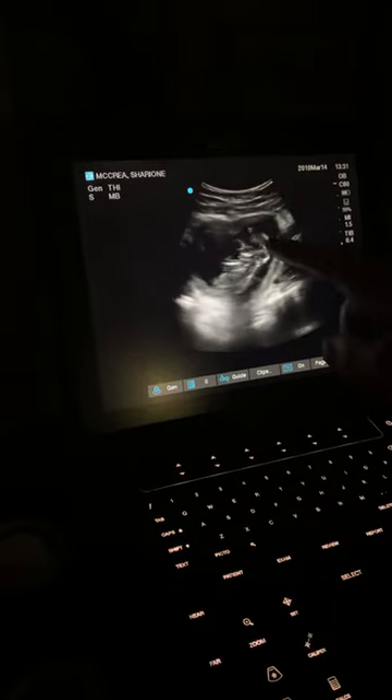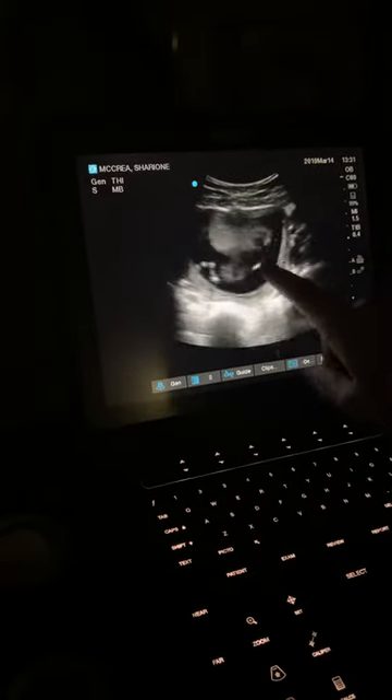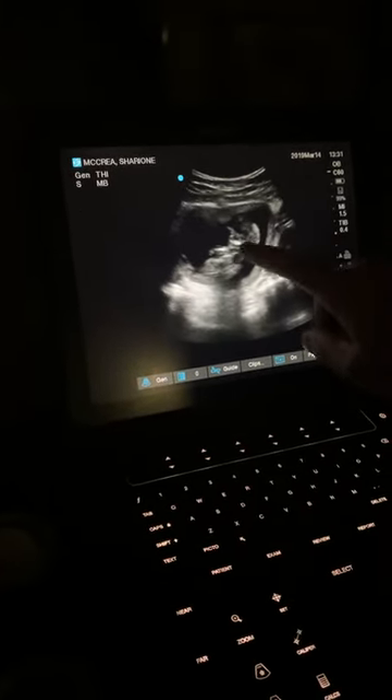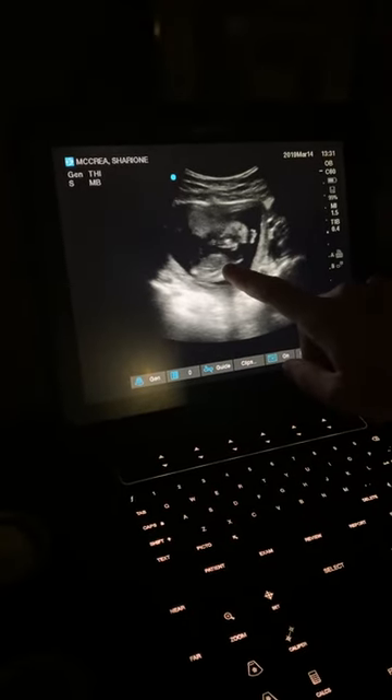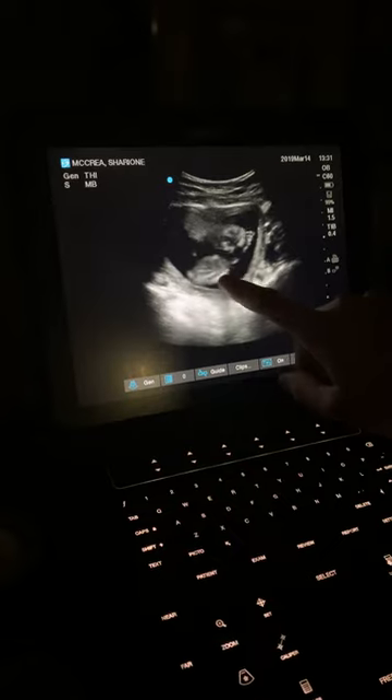So from kind of an anatomy standpoint, this is the placenta up here, this is kind of the noggin, upper extremities, tailbone through here, and here's that little pitter-patter of the heartbeat that we were measuring earlier.